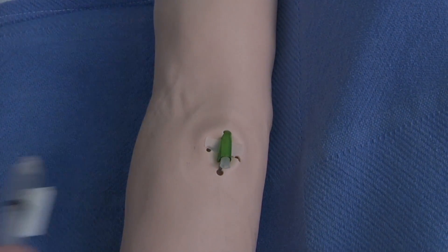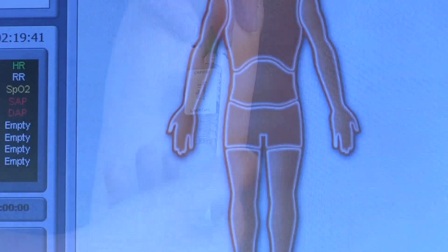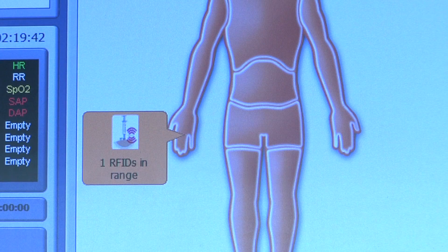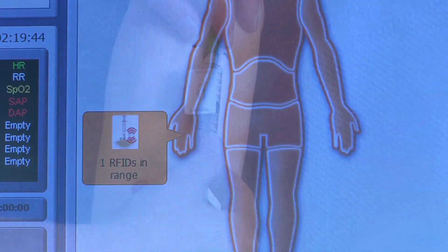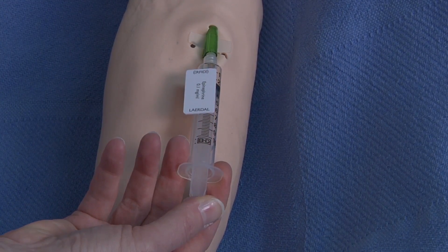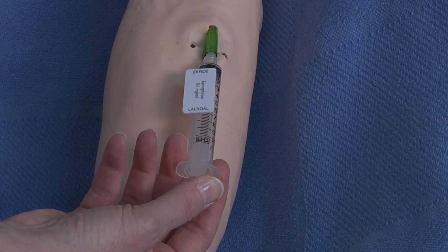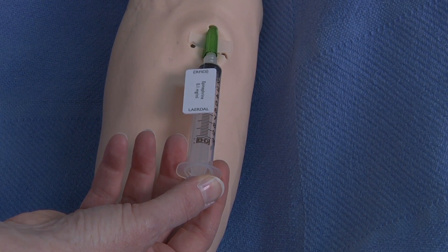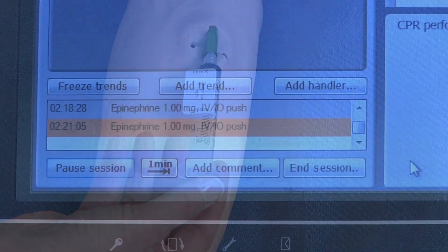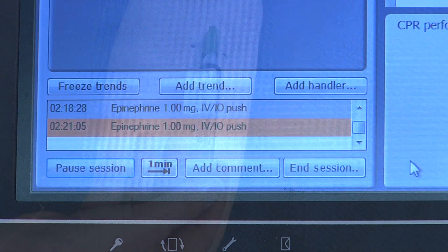One of the most innovative aspects of SimMan 3G is its automatic drug and event recognition system, whereby a radio frequency identification label on the syringe transmits which drug is used. A flow meter measures the dosage, and the mannequin provides the appropriate physiologic response.